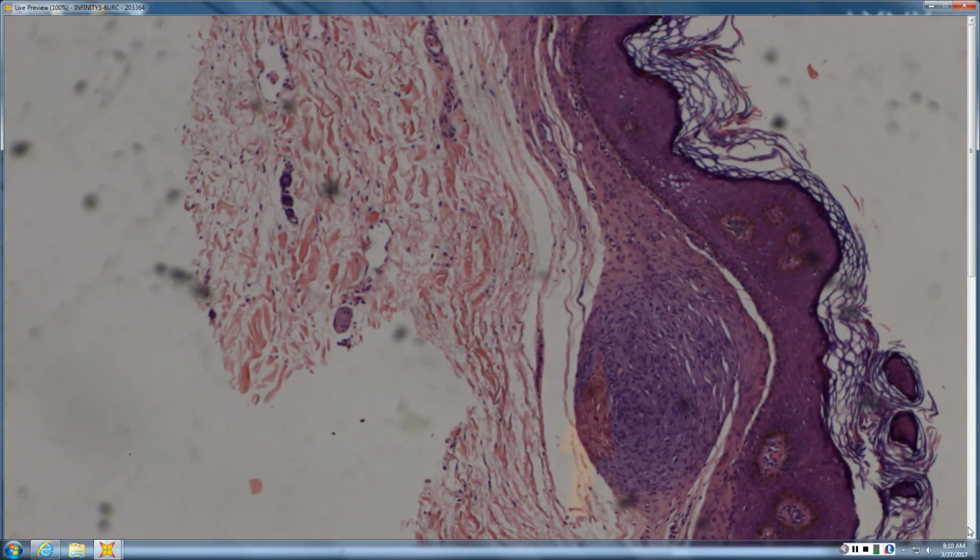Perineurioma is EMA positive. You can occasionally have myxoid perineuriomas, and you know that it's not a nerve sheath myxoma because it's EMA positive instead of S100 positive. And you have sclerosing perineuriomas, and they have the shallot or leek appearance with the EMA positivity.